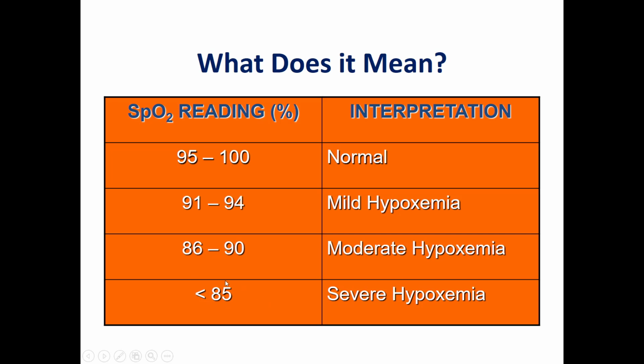As we said before, when making the R curve and the lookup table, we should avoid reducing the SpO2 in the blood below 85%, because we will have severe hypoxemia, and this will result in irreversible damage to the patient, to the subjects. For this reason, we avoid measuring blood samples below this level when making the R calibration curve.